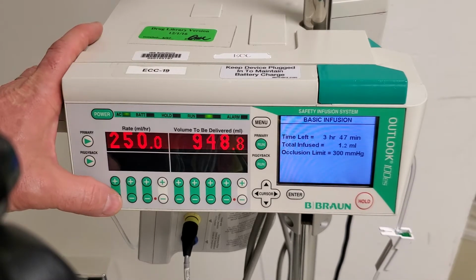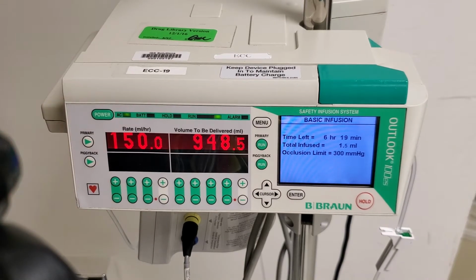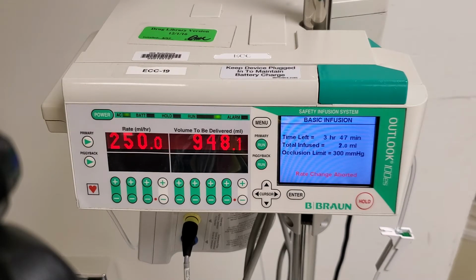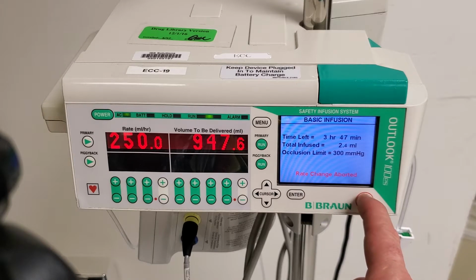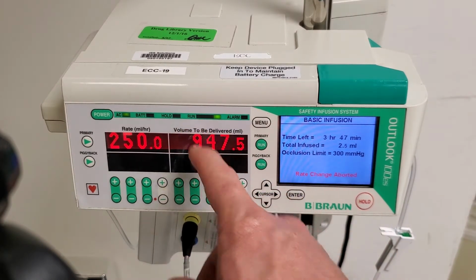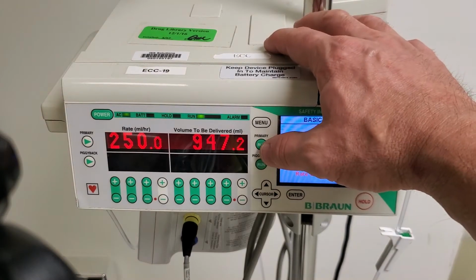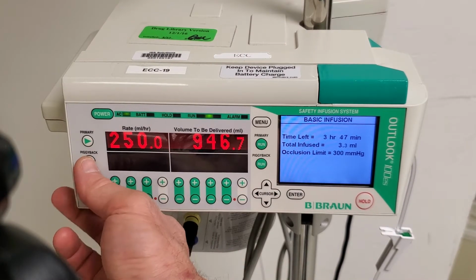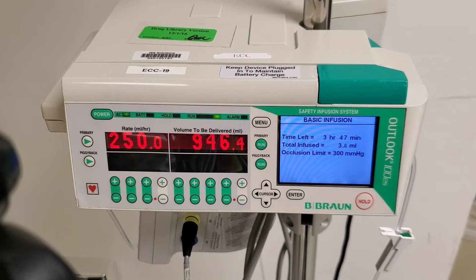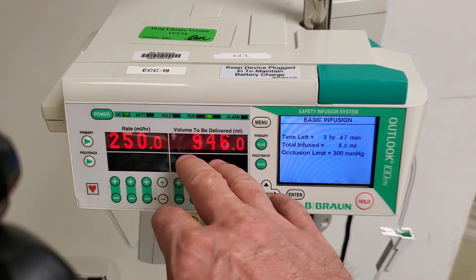If I make a change, but I don't hit run to confirm, notice that the pump will alarm and revert back to the original rate. Now there's an alarm sounding, and we have to stop that. We can press hold to stop the alarm, which will stop the pump. We can restart it after that, or we can hit run to stop the alarm and keep the pump running. We will learn about the piggyback infusion a little bit later, but that's the basics of running a basic infusion.